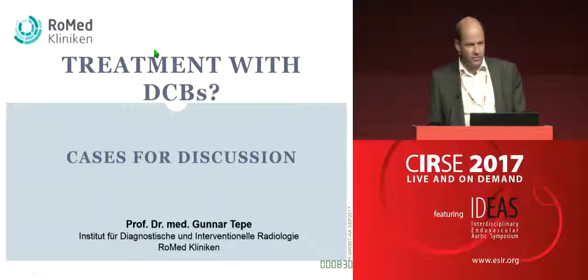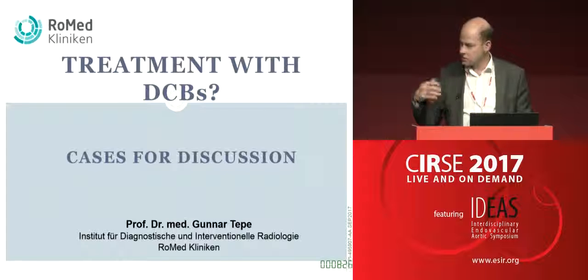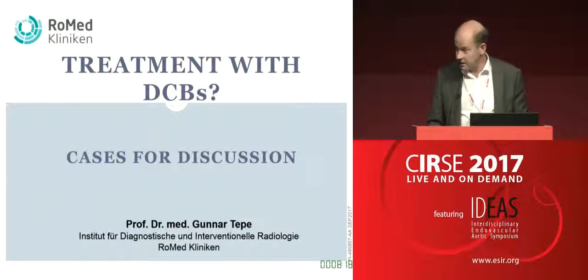I prepared 3 different cases here for all of you, and first of all, I'm just going to put up the case, show you the lesion, and then we can discuss how you would approach, and then I can show you what I did, and then we can discuss if this was a good solution or if I did bad.